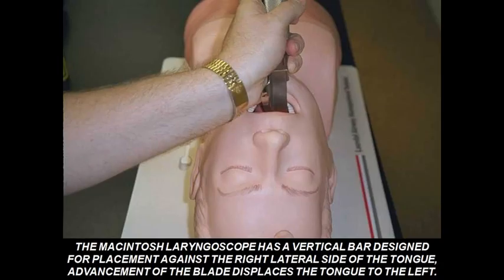The success of this technique is predicated on proper positioning of the laryngoscope blade on the right side of the mouth. The laryngoscope blade must be placed on the extreme right side of the mouth, very close to the right-sided molar teeth.